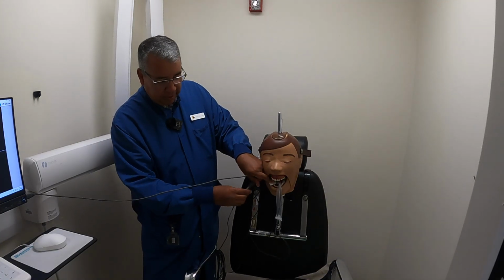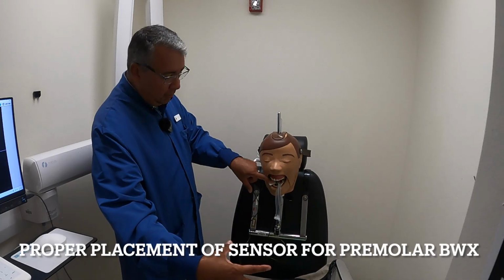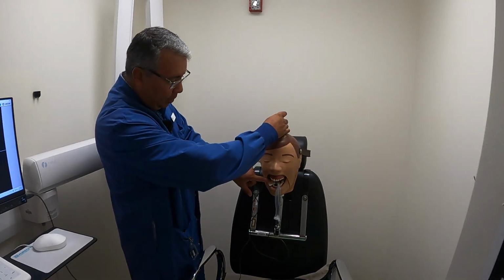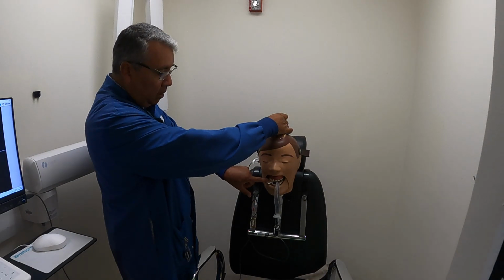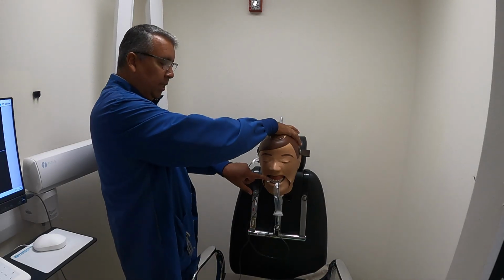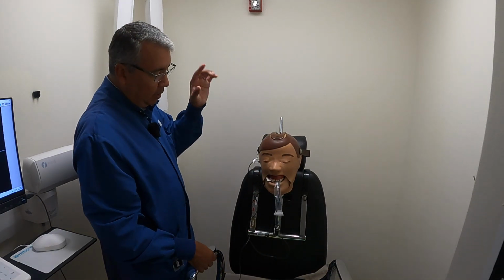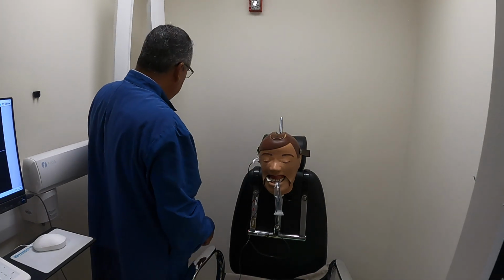Okay, that's my cue to walk around the other side. I'm not standing in the front of the patient. I'm just staying on the side that I'm working on. And I'm going to go ahead and close this patient. How? Slowly. All the way. I'm going to rotate my finger to the buccal. The patient closes down all the way, and not until then, I'm just going to keep my finger on until that's done, and then I can take my finger off.